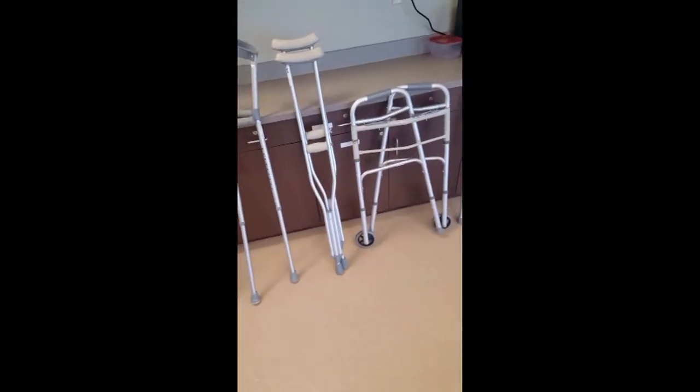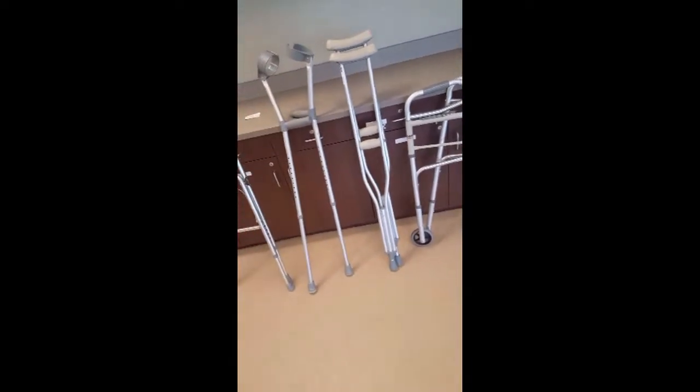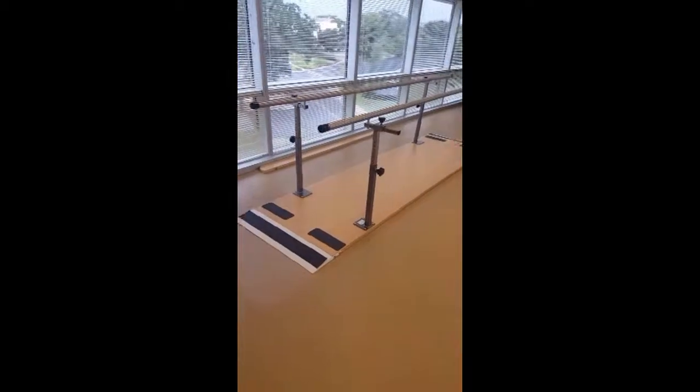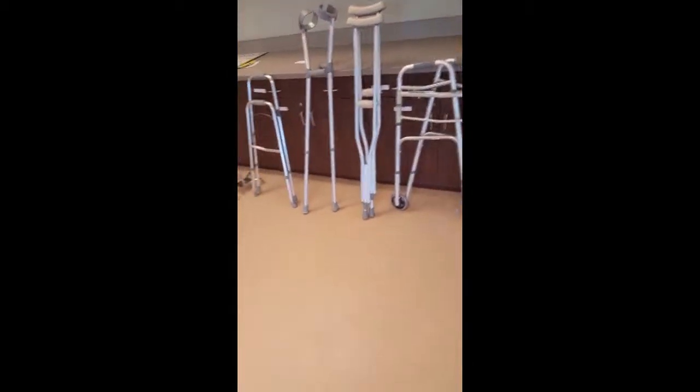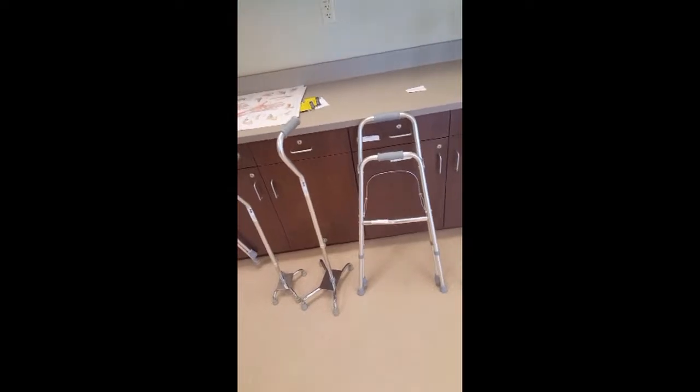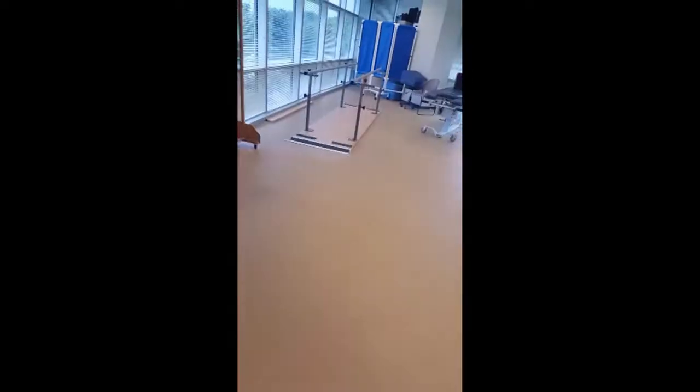And also, it depends if you want to do something short term. If you want to train them for gait, you might want to use a parallel bar. But for daily use, you might want to try something more mobile. But really, for weight bearing as tolerated, this patient allows for any unilateral or bilateral device.